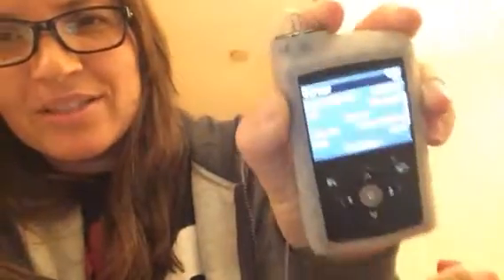First of all, I'll show you quickly where your Isig is located. Your Isig is located under your status. I hate the reflection because I can't see anything at all. I don't know if you can either. Status, sensor, and then you just scroll down until you see Isig. Okay, so my Isig is a 19.05.